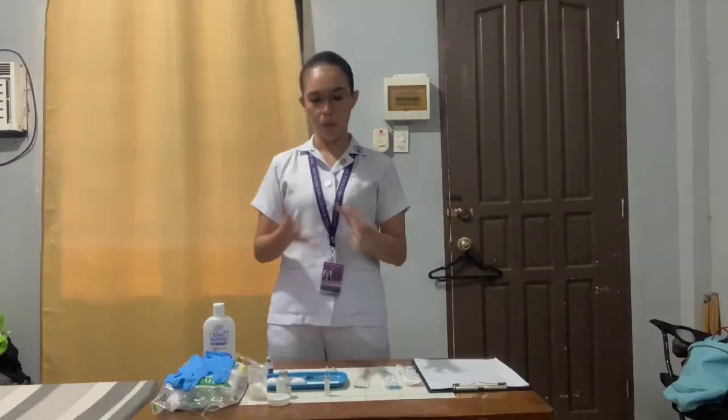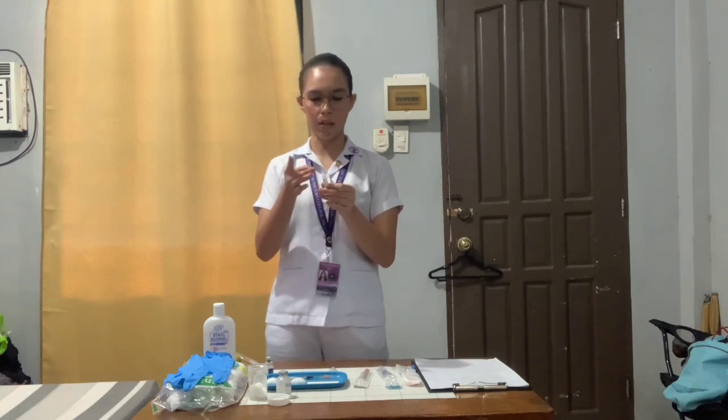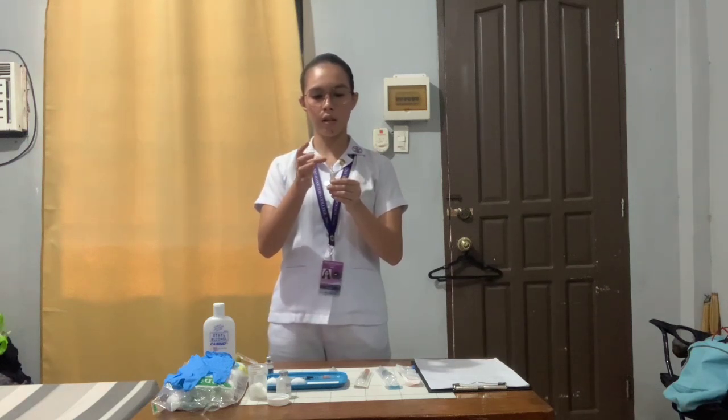So now I'm going to proceed in preparing the medication from the ampule. We have here our ampule, so we are going to flick the upper stem of this ampule several times with a fingernail, making sure that all of the medication is on the lower part of the ampule. So now we are going to use the ampule opener, or we are going to place a sterile gauze or alcohol wipe between our thumb and the ampule neck to make sure that we won't hurt ourselves.